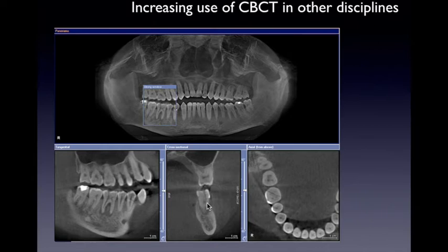Therefore, determining or assessing the restorability of the case and ergo plan better with better prognosis to our patient, less repeat procedures in the context of maximizing our ability to see what is inside.